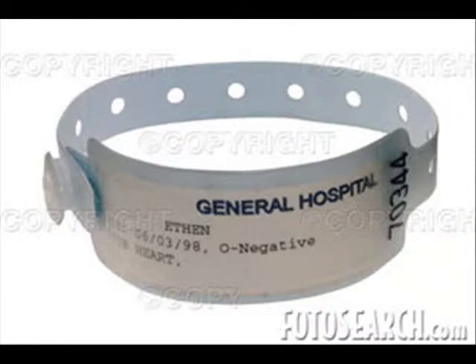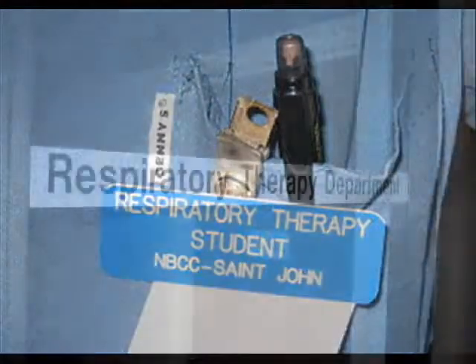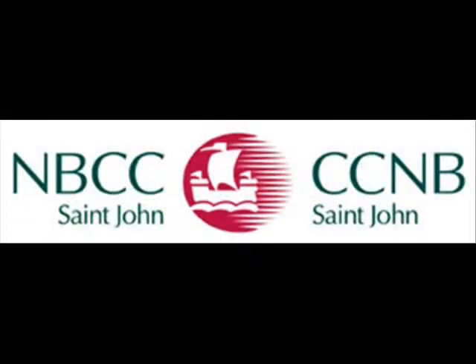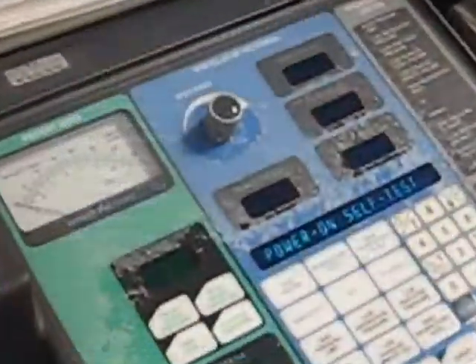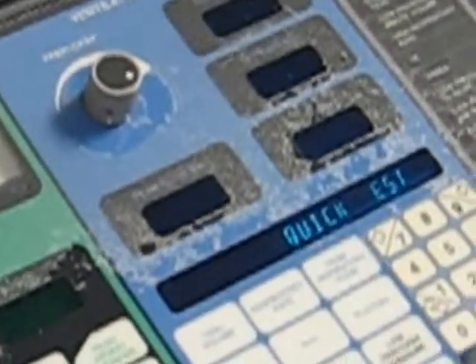Identify the patient, yourself, the department that you represent, and your role as a respiratory therapy student at NBCC SJ. Follow the pre-use check according to the manufacturer's specification or the local policy and procedure at the site in which you are rotating, which can be found in the Policy and Procedure Manual.